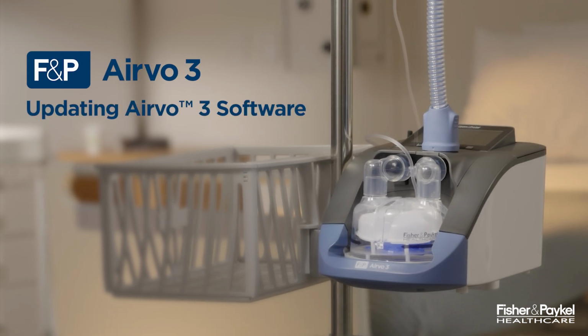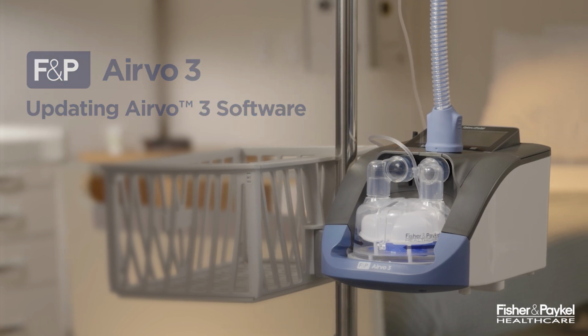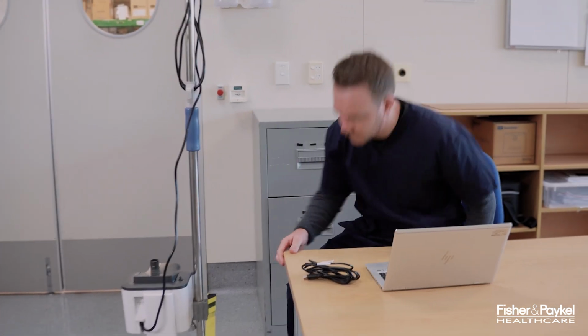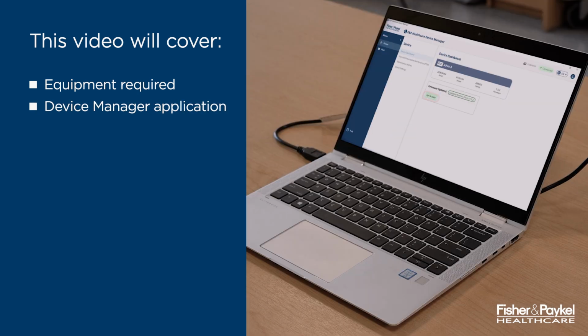Welcome to this tutorial on how to update Airvo 3 software using the F&P Device Manager application. This video is intended to be used by those responsible for applying software updates to the Airvo 3 suite of devices, such as biomedical service technicians. This video will cover equipment required, how to install the Device Manager application, and how to use the application to update Airvo 3 software.